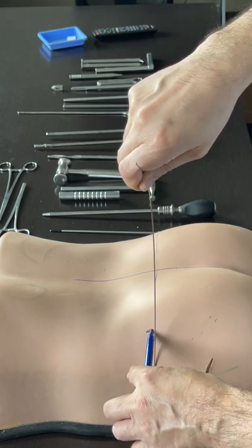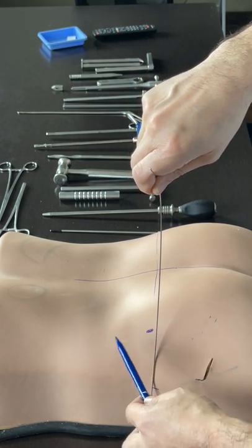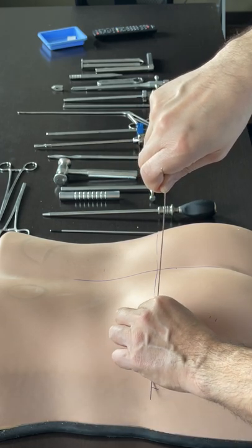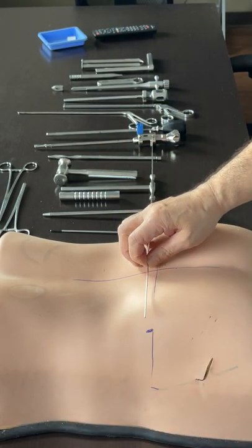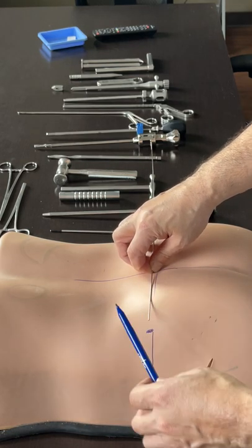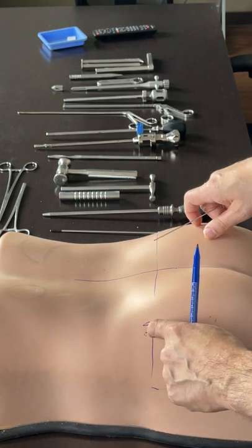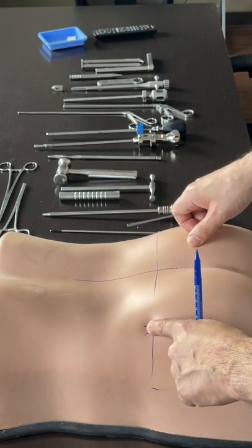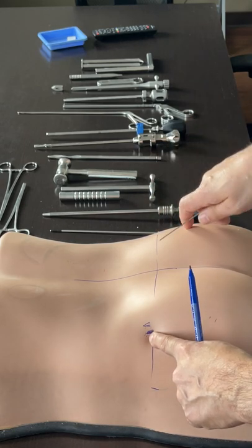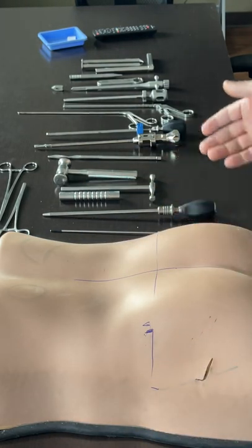I go to where the patient's direction of the skin changes - goes from horizontal to vertical - I mark this, and then transfer this distance to the midline, to the continuation of the same line. It may align or may not align. Practically, you have two lines: the upper one, closer to midline, lets you go more steep; the bottom one lets you go more laterally, and you can even come a little lower and perform a direct lateral with this instrumentation.